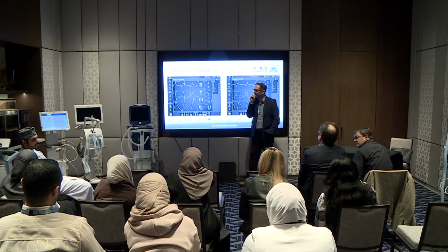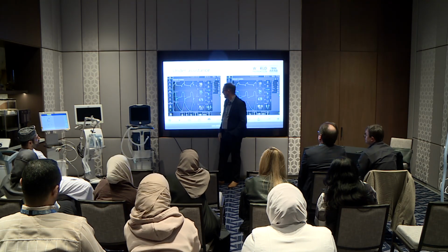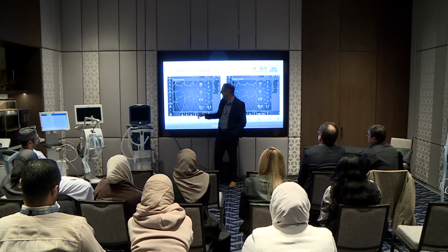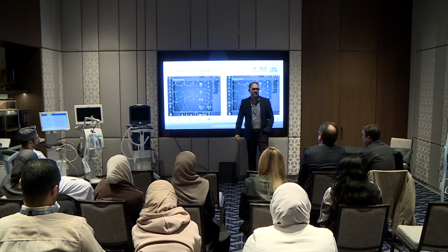Because you have the shoot up of peak pressure. There's a huge spike here, right? And then you have pressure control of 6 above 12, it should be about 18. If you look, it's 25 is the peak here. You can see how high the spike is. And it's then just reaching 0. Yeah, auto PEEP, there is auto PEEP.